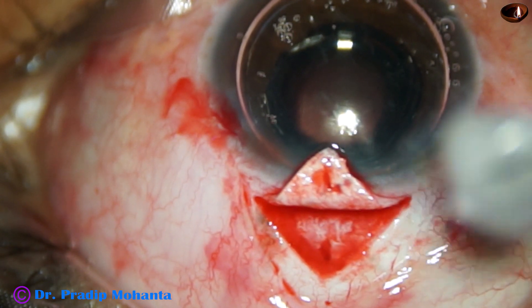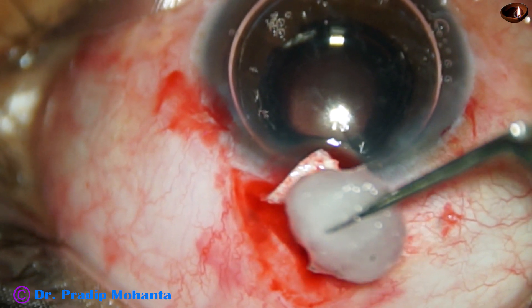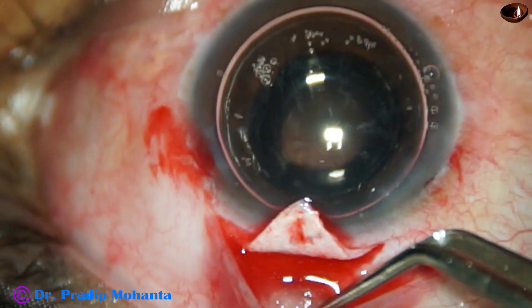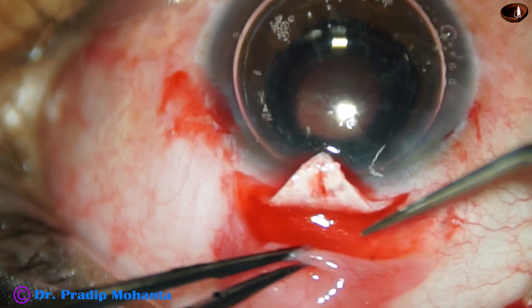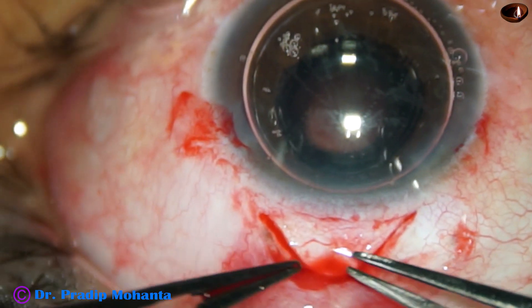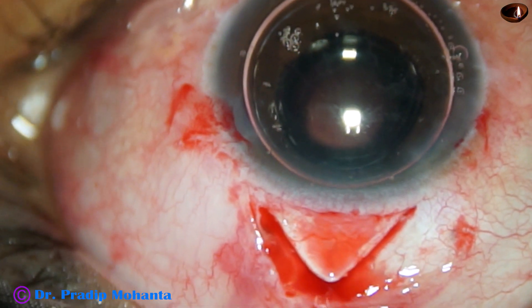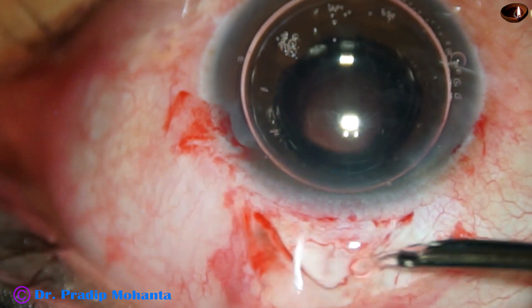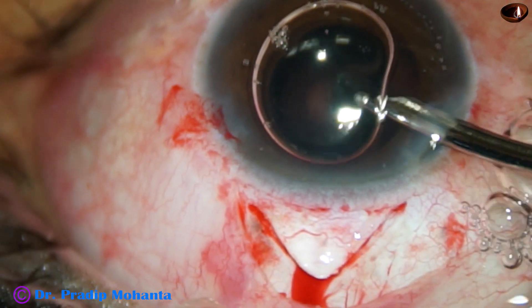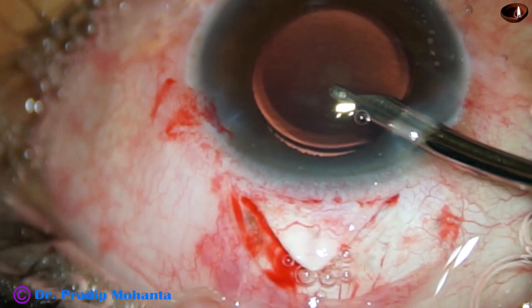And now I'm going to use a bit of mitomycin C. Just touch the undersurface of the scleral flap, and the mitomycin C soaked cotton ball is placed where the bleb will form, underneath the tenons. It is kept for about one and a half minutes — about 90 seconds. And then the cotton ball is removed and the area is nicely irrigated.